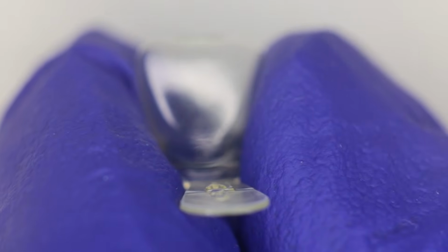This segment or flap is indicating the tooth number and the dimensions. So we need to remove this neck part over here so that we can then place the crown. This is step 1. We need to cut this crown to the desired shape. So step 1 is selecting the crown.